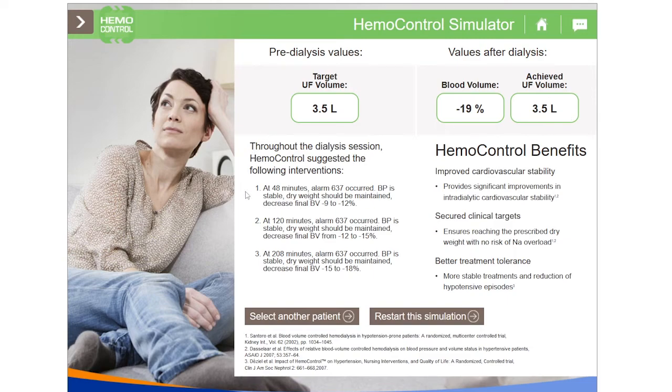And then it's going to kind of go through the 3 different adjustments that we made. So again, my 2 cents is that rather than only making adjustments when the blue reminders pop, I think it's more effective to be proactive. Consider your patient's condition, look at the forecast values, and cater your treatment to them rather than only when the machine tells you to do so. But you can take that with a grain of salt.